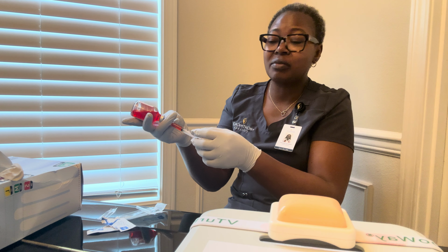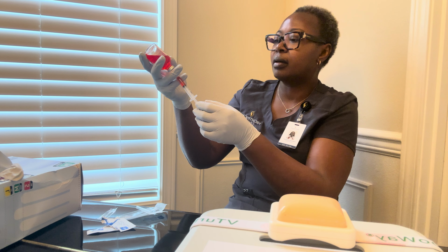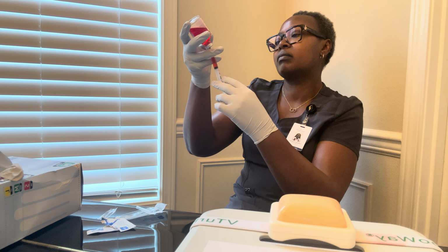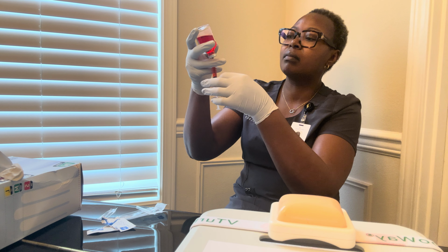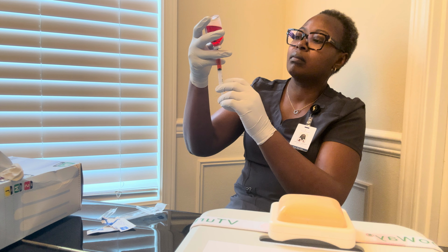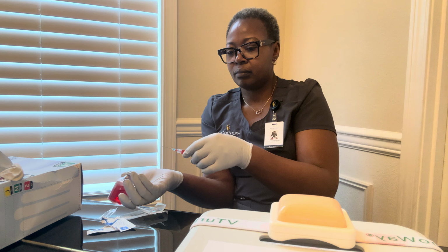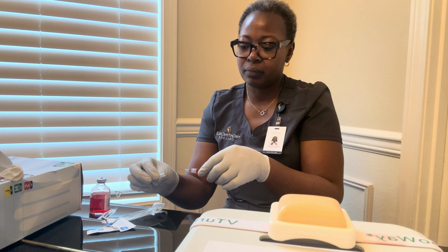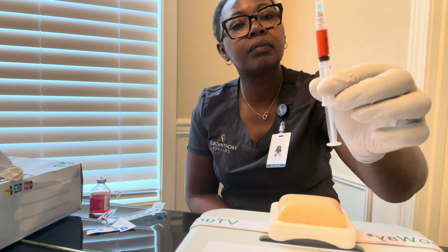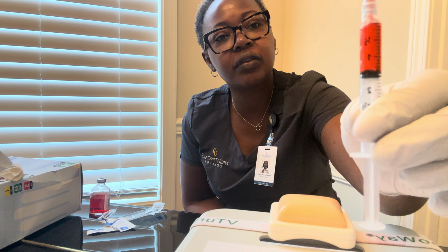I'll make sure I don't have any bubbles before I inject. So I'll remove all the air. No bubbles, and I have 1.5 ml.